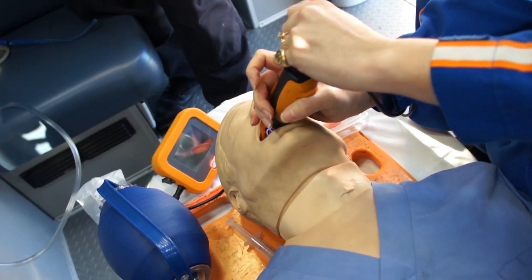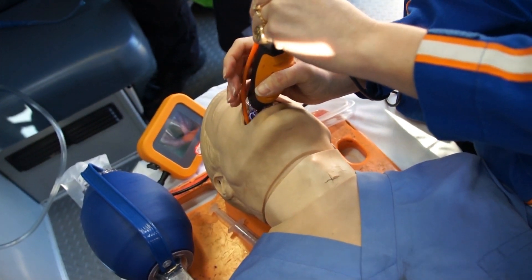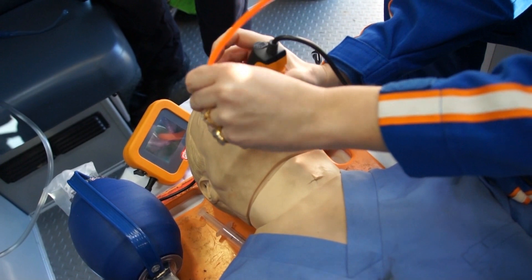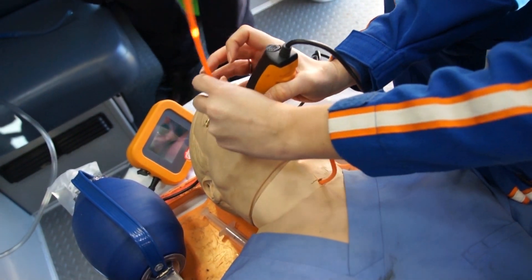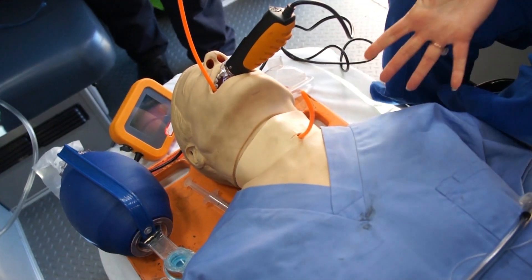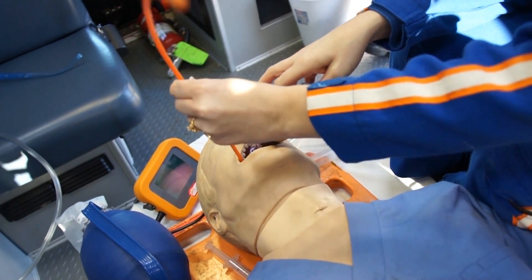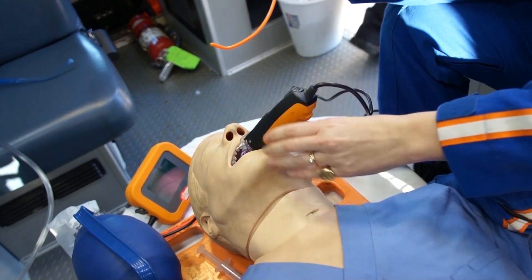When you like that, just come back a little bit with the scope. There you go, look at that — beautiful. Beautiful work. You can do it from across the room, you can do it at the head of the patient.